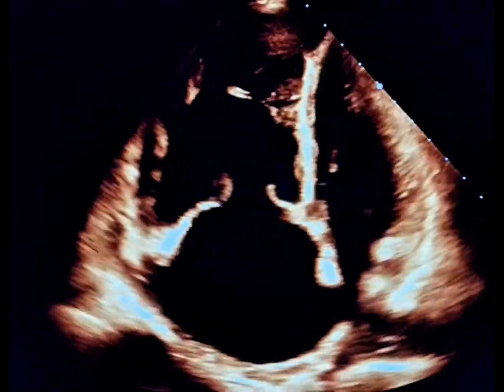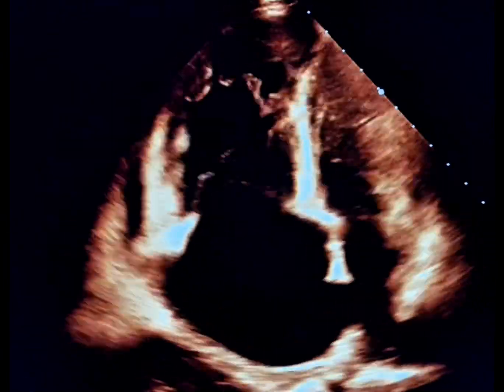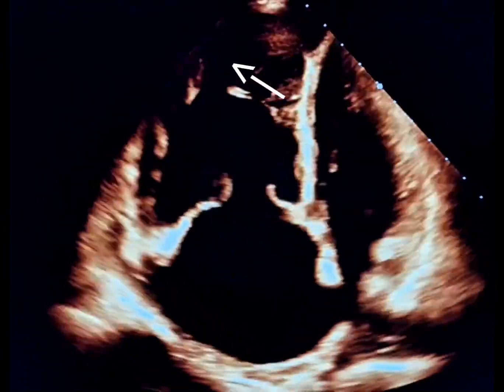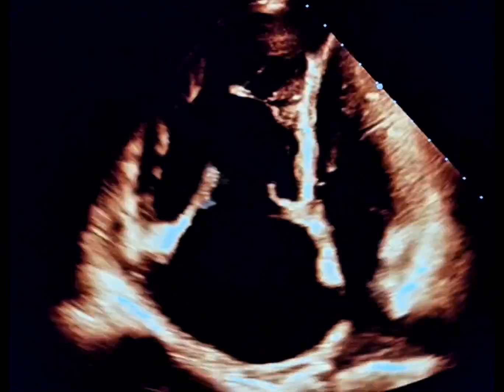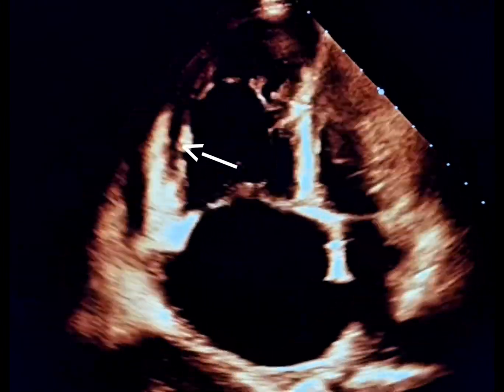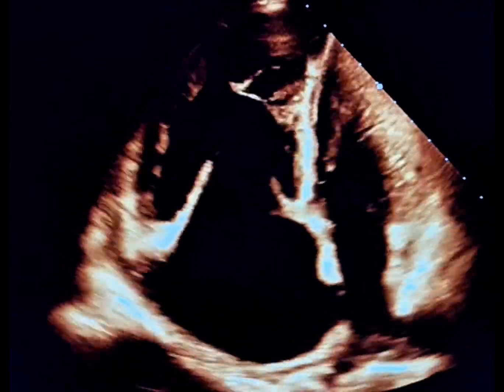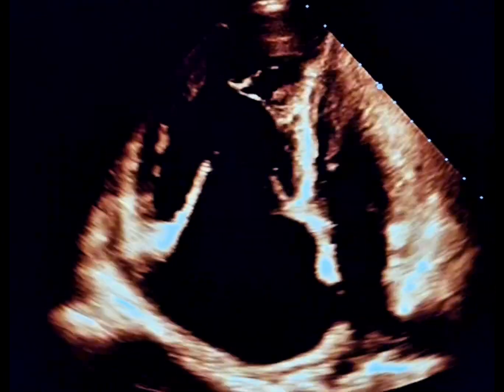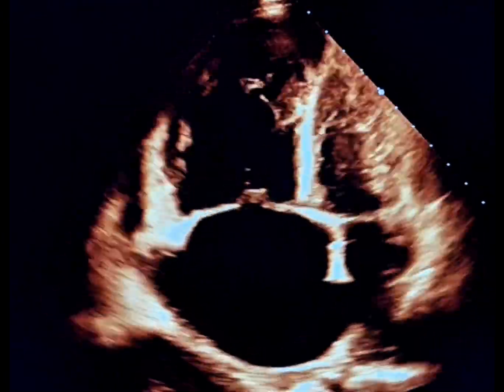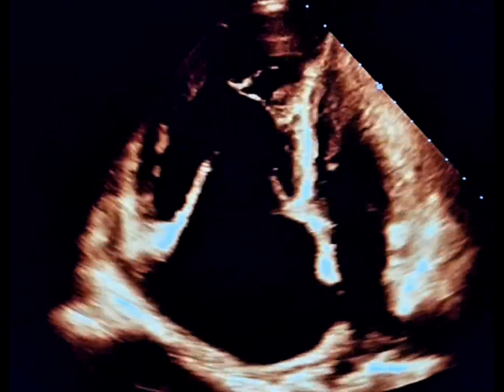Instead, we observe a pattern of hypokinesia in the mid to apical segments of the right ventricular free wall, while the basal segments remain hyper-contractile. This phenomenon represents a reverse McConnell's sign, which, though rare, can also be associated with pulmonary embolism.